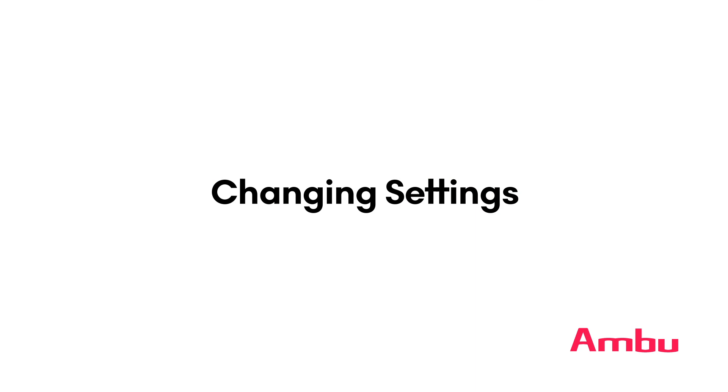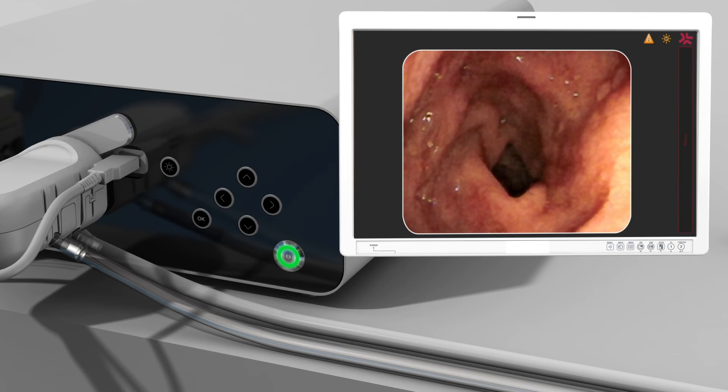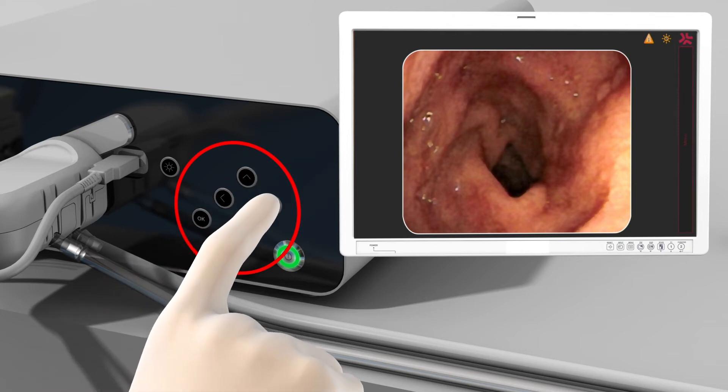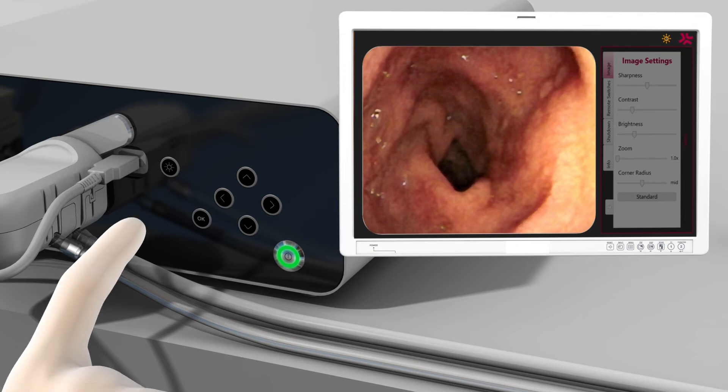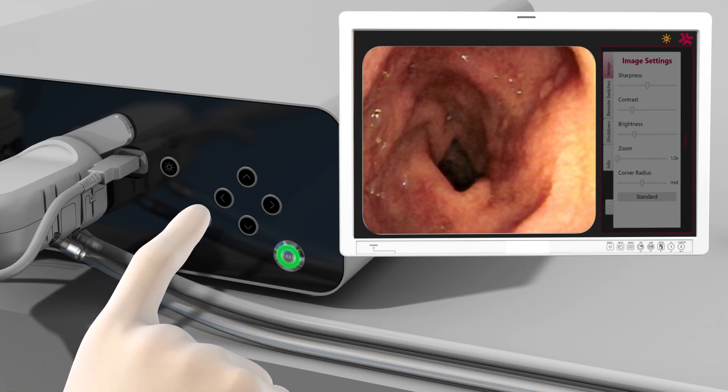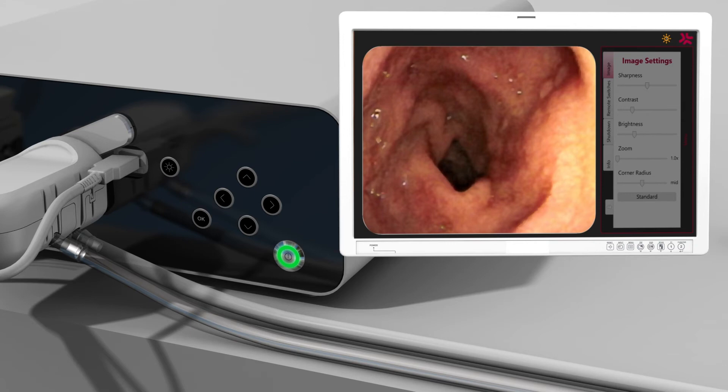The A-Box Duodino allows you to set a variety of preferences to personalize procedures with the system. To make these changes, navigate to the settings menu by pressing any of the navigation keys located on the right side of the A-Box Duodino front panel. Changes can be made without a scope connected; however, it is strongly recommended to only make image adjustments with an A-Scope Duodino properly connected. It is recommended that preferences be finalized before starting a procedure; however, access to settings is active at all times while in exam mode. Press the OK button on the front panel after making a change to save the new settings.